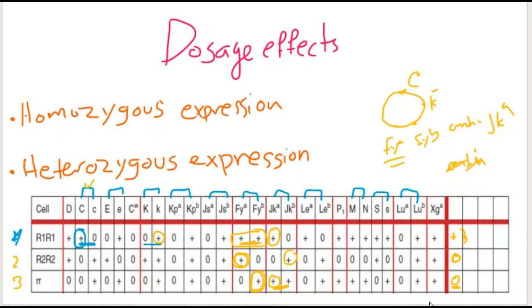And if you don't understand it, don't worry, we will discuss it in more detail again in the antibody identification test. Here we just want to have an idea about homozygous expression and heterozygous expression, and the importance of this point.